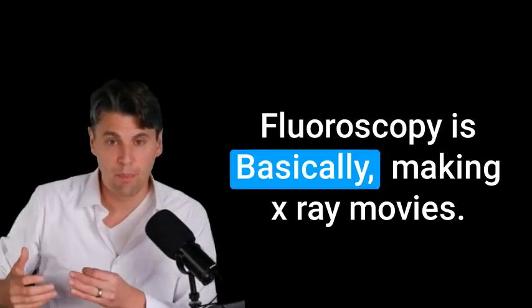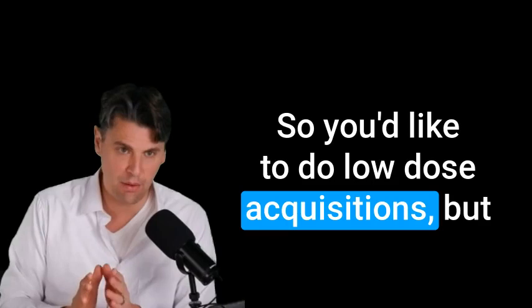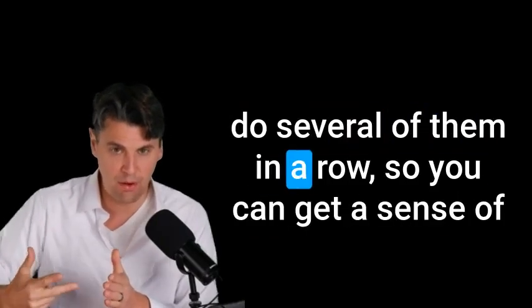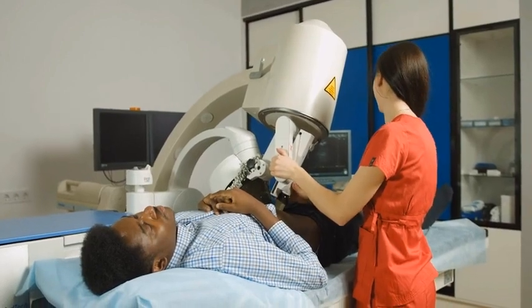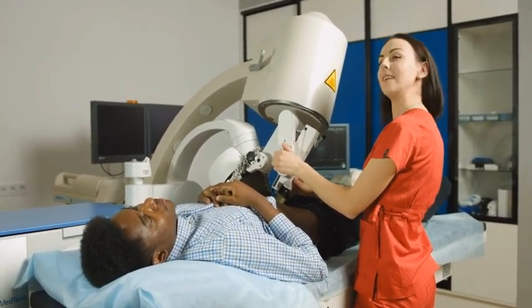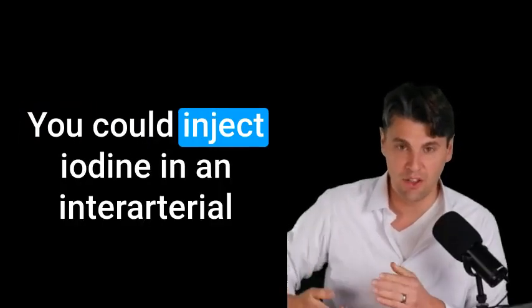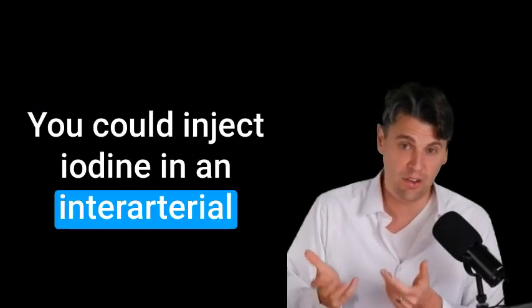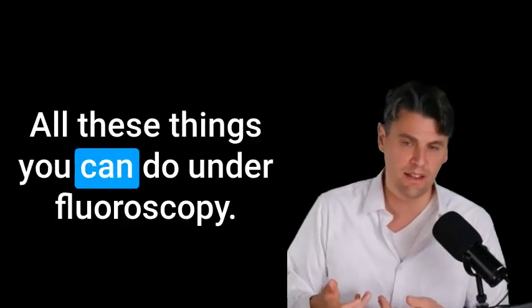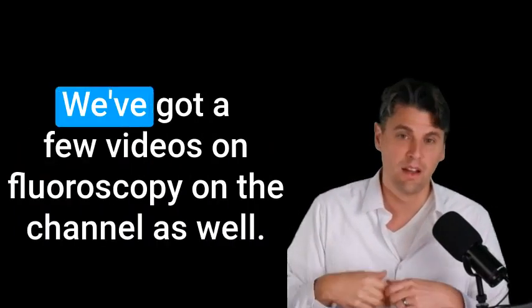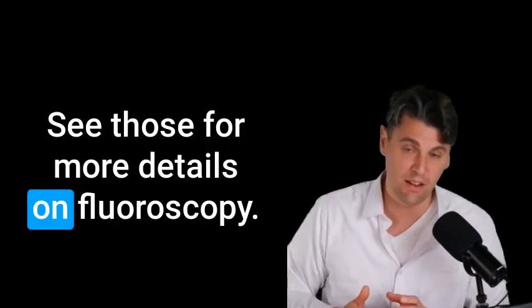I've talked mostly about the standard radiography system so far, but fluoroscopy is basically making x-ray movies. So you'd like to do low dose acquisitions, but do several of them in a row. So you can get a sense of someone swallowing something, or if you're inserting a catheter, you can track the tip of that catheter. You could inject iodine in an interarterial injection, which is actually higher contrast. All these things you can do under fluoroscopy. We've got a few videos on fluoroscopy on the channel as well.